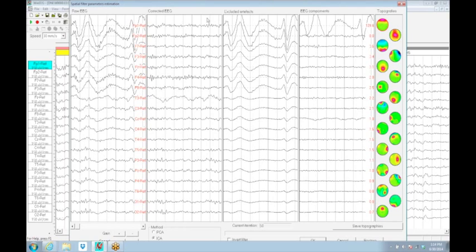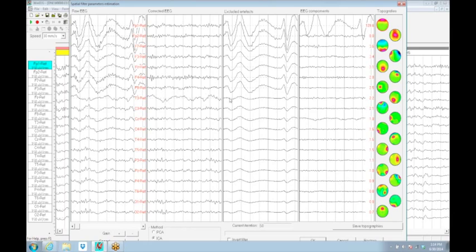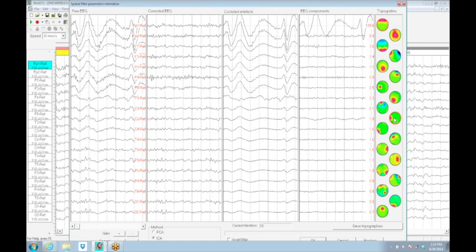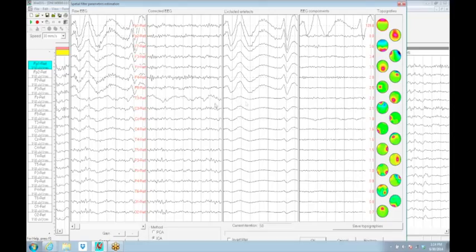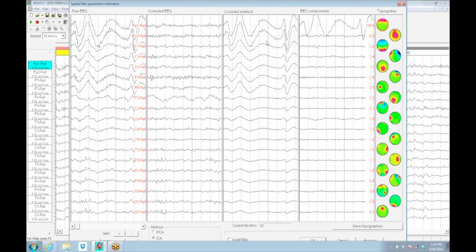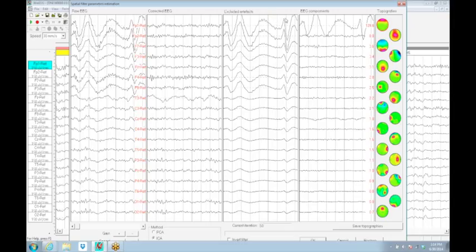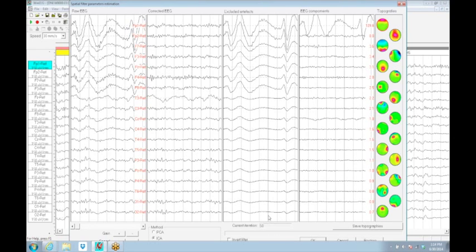Now you can see this is the EEG minus the eye movement, which leaves us with this T3. The entire T3 had an irregular baseline wanderer to it. That's this component. But when you select that, you also virtually flatten out the T3. This is not always the best way to fix something. But it's done a very nice job with the eye movements. If you look very carefully, there are small little wiggles here that we wanted to take out as eye movements. It's pulling some small things out here too.